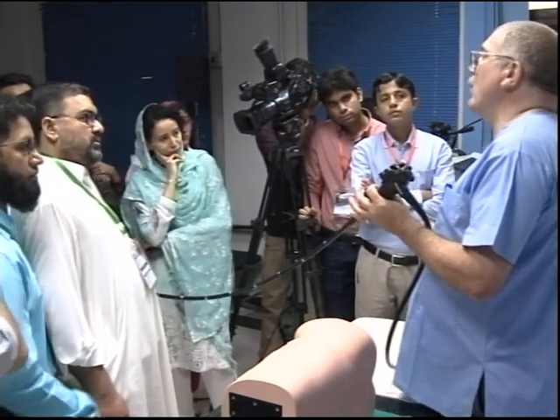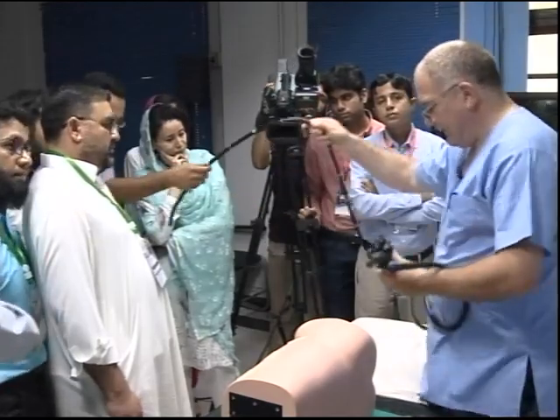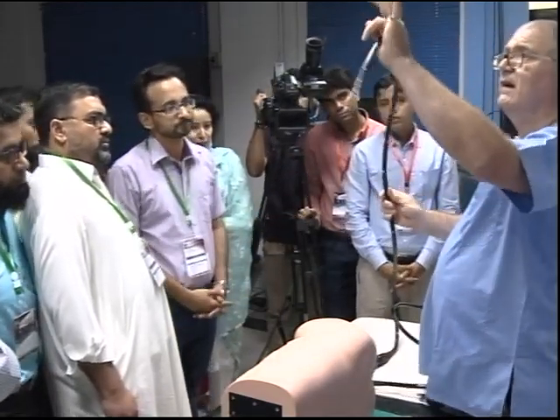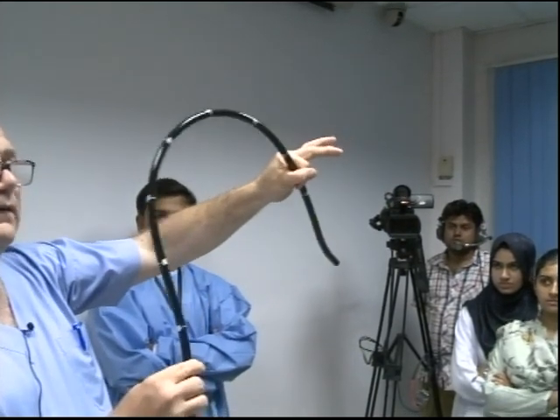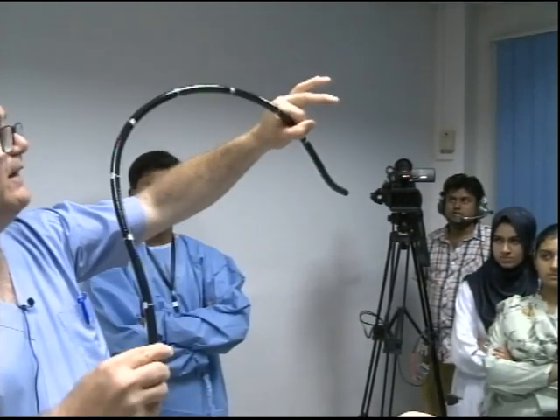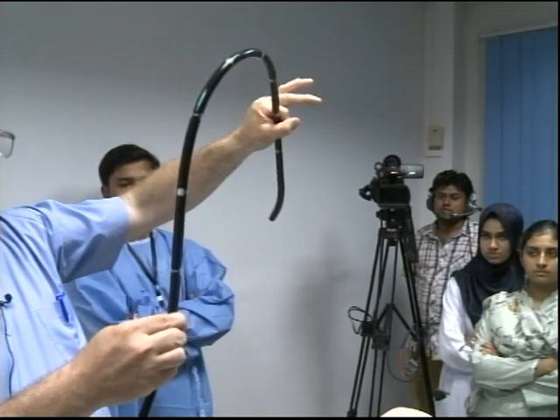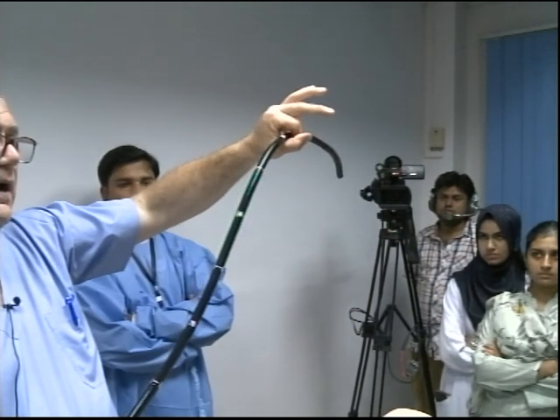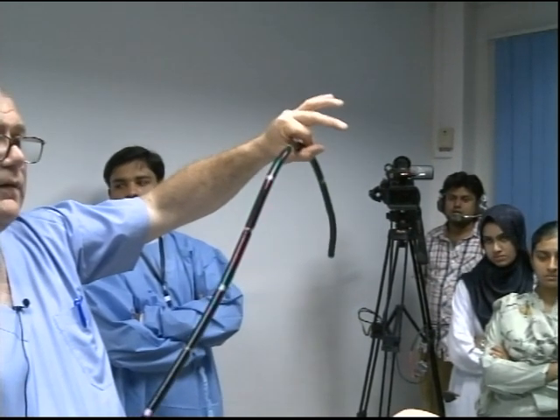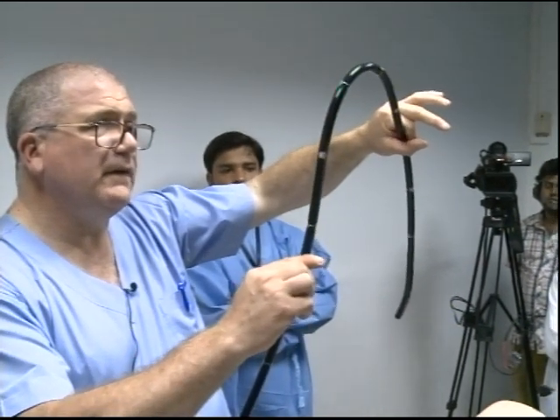So what you've got there is a concept, an idea in your head, of how much you have to draw out. We actually self-limit. So if we bring the scope here, I have a loop. This is easy, see it? It's no trick. Scope is here. I have a loop. Scope wants to go forward, yeah? Scope is looping, yeah? Can you see it? No trick, yeah? I then get the loop, I actually apply, watch the thumb, anti-clockwise torque, bring the scope back, keep the torque on. What's the scope doing? I let go of the torque. What's the scope doing, even though I'm going in the same direction?